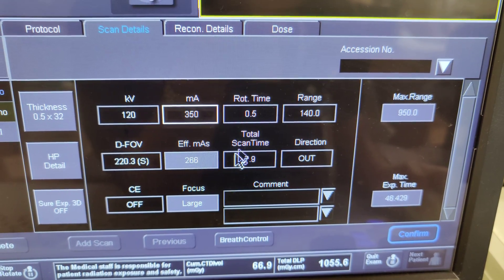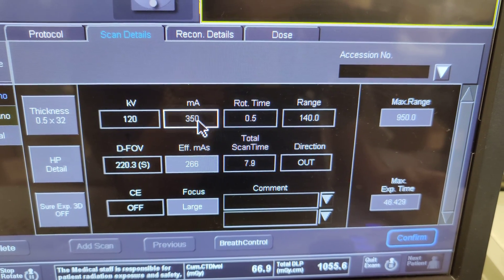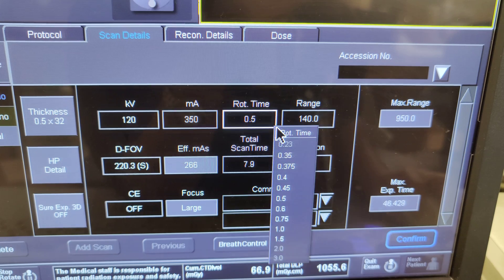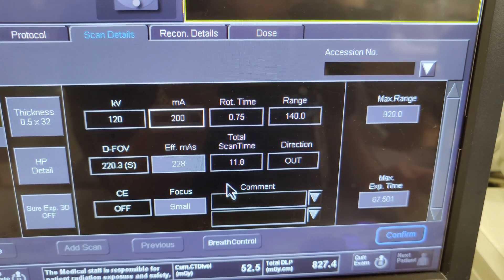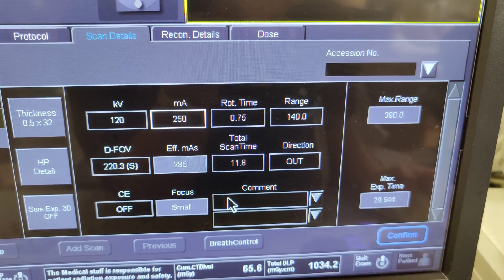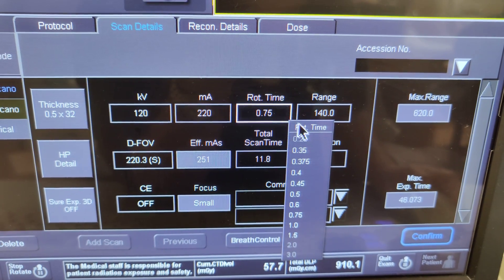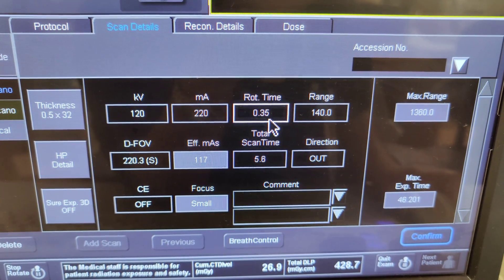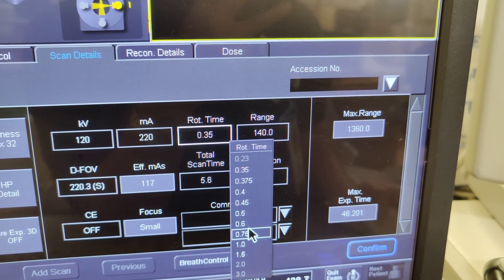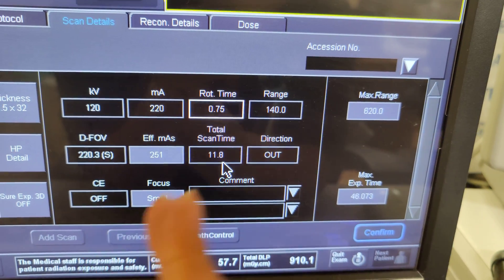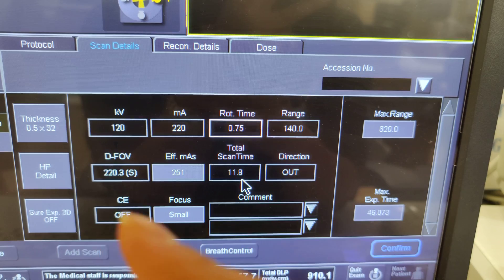Your MA is going to go up while your rotation time comes down — they go the opposite way. If rotation time goes back up to 0.75, the MA goes back down — it was around 220 — and you're back at that ballpark number. The fastest rotation time is 0.35 seconds. Notice that the total scan time changes: the regular scan was 11 seconds from the base of the skull to the top of the skull.